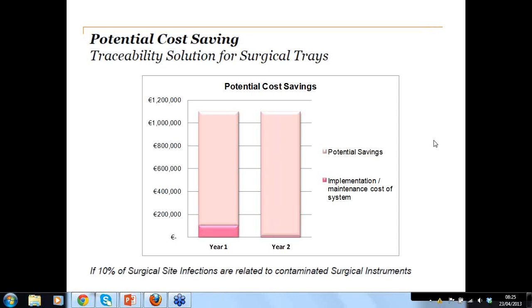Well, do you mean just to manage the traceability of these trays moving from the bigger hospitals to the smaller hospitals? Yeah, correct. Well, if this system is in place, you'd have the GS1 system implemented in both the large hospital and the smaller hospital. So all the information is stored in a server. It's called the GS1 server.